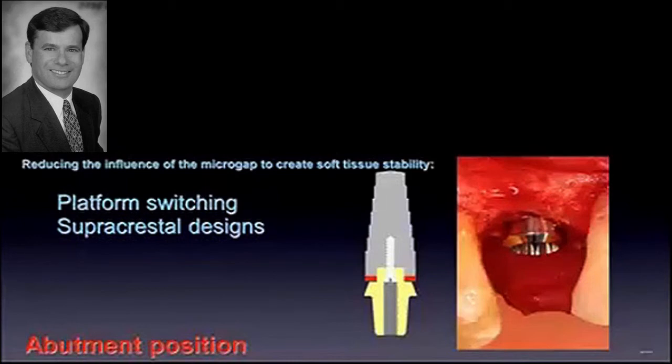So essentially, you are medializing the abutment implant connection, and that's the platform switching idea, and then creating a distance. So you have essentially still an irritating microgap, but you're moving it further from bone. In a sense, it's a very clever idea. It was serendipitous, but it did occur, and they found that they had significant benefits when they moved it medially.